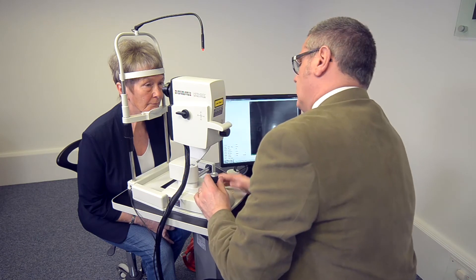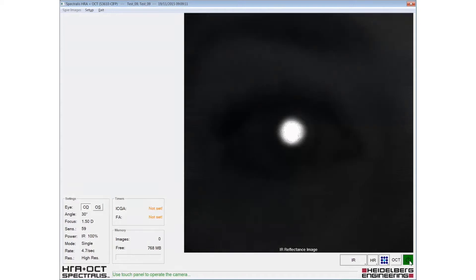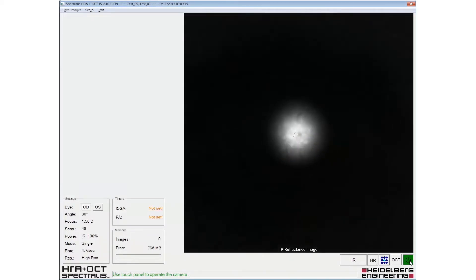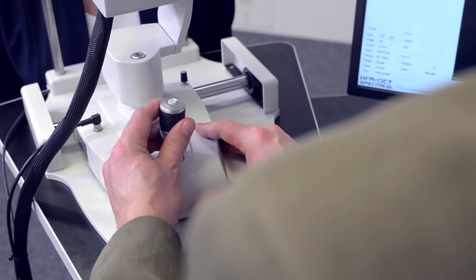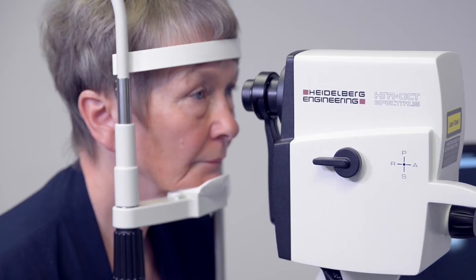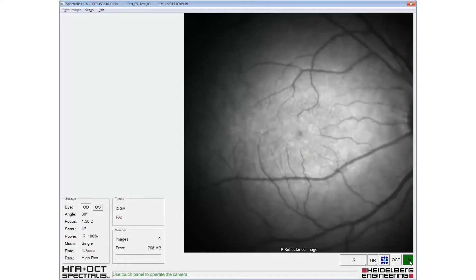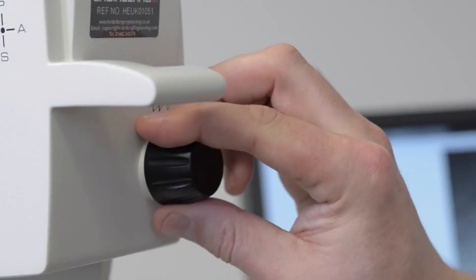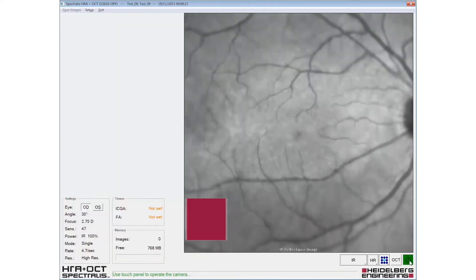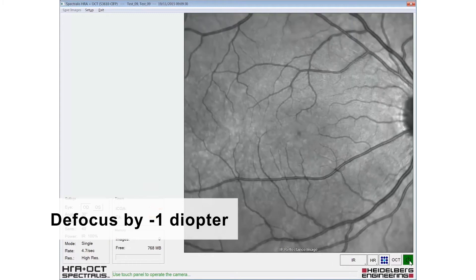The patient should be instructed to look at the internal fixation target. The fundus image is aligned by sliding the camera head forward, keeping the reflex from the patient's pupil central. The fundus image should be evenly illuminated from edge to edge, then adjusted for sharp focus in the IR mode and a minus 1 diopter defocus applied before selecting multicolour.